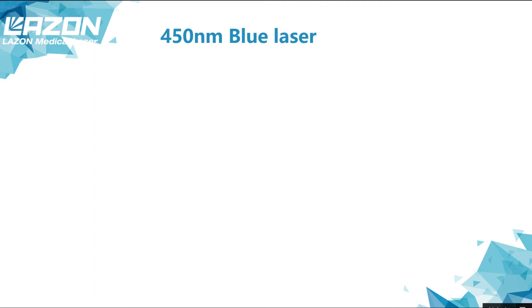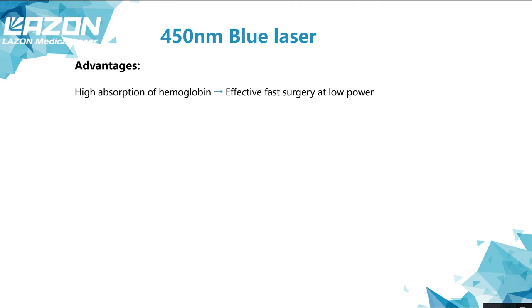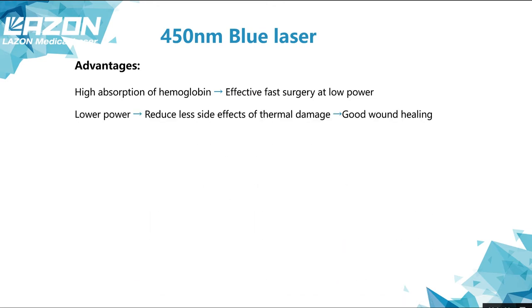450 nanometer blue laser has been used in dentistry in recent years and is getting more and more popular. Compared with infrared laser, blue laser can achieve more effective surgery at lower power because it has very high absorption of hemoglobin. In some articles, the cutting efficiency of blue laser at 1.5 watts is even better than 980 nanometer at 3 watts. That means you can cut faster and easier, and using lower power can reduce high temperature damage to the surrounding tissues. Besides, using 450 blue laser, you may not need tip initiation.